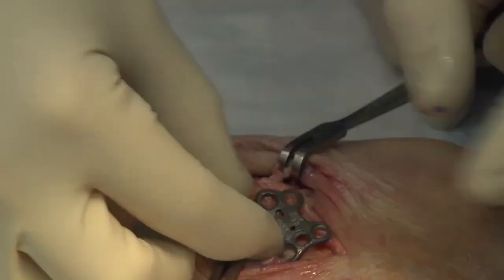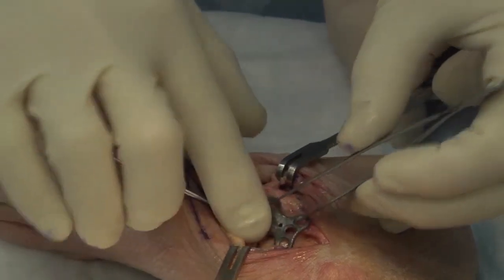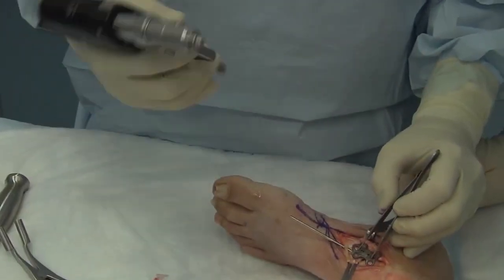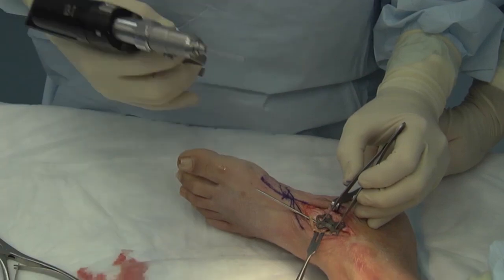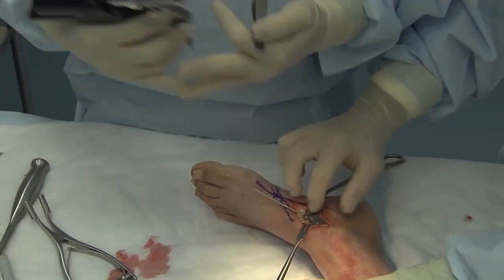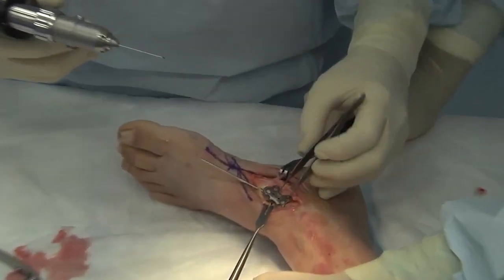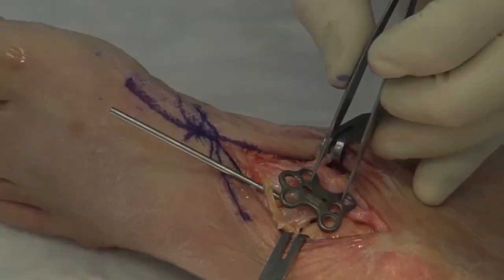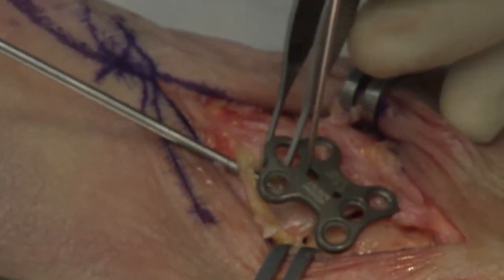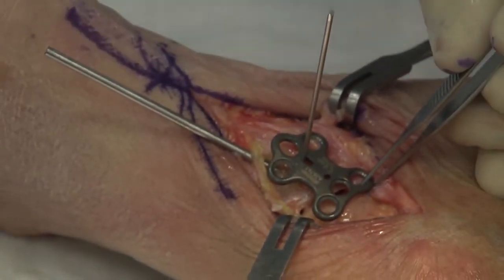You can see the design of the plate with three screws proximal and three screws distal. It's important when doing these fusions that we get compression across the joint — fusions heal best when you have maximum bone contacting bone, with a good joint prep, lack of cartilage, and all fibrous tissues removed. We've fenestrated the subchondral bone and now we need to compress that. This plate has a dynamic K-wire hole and a static K-wire hole.